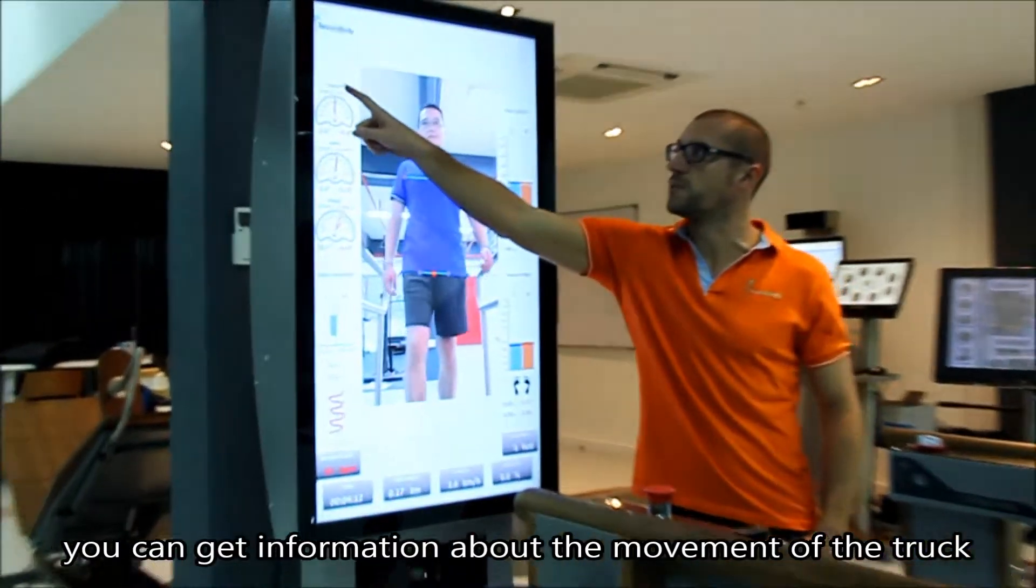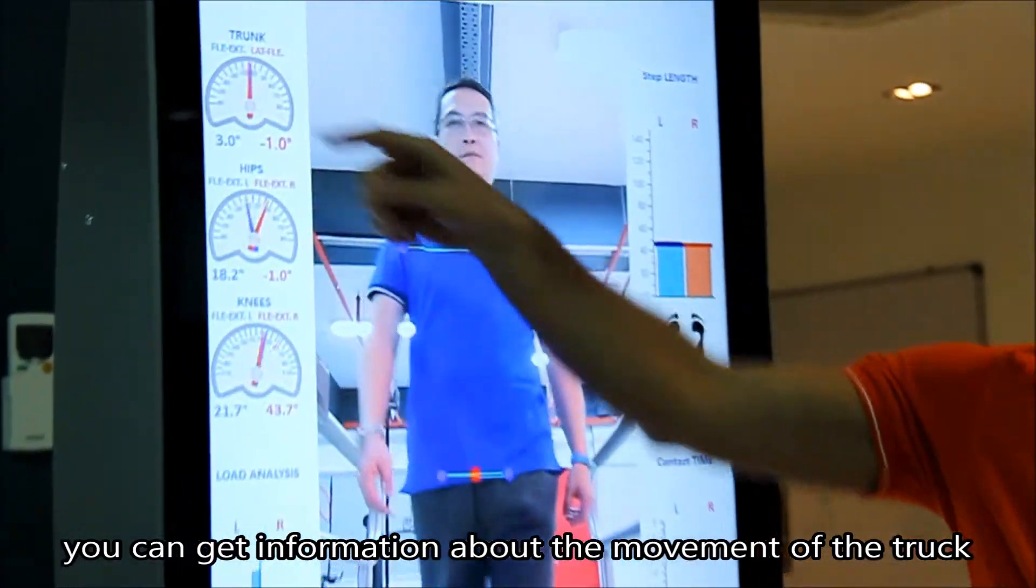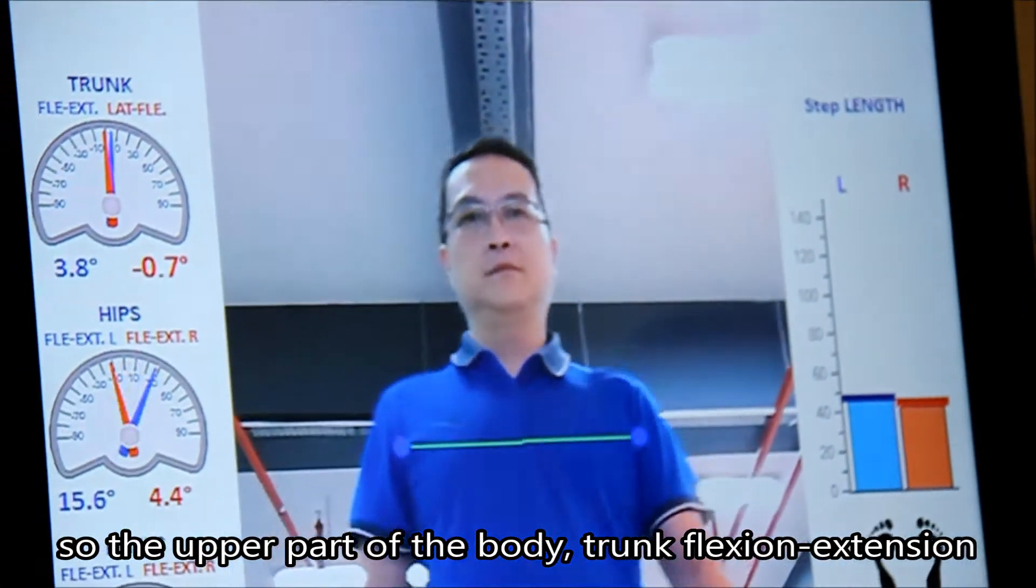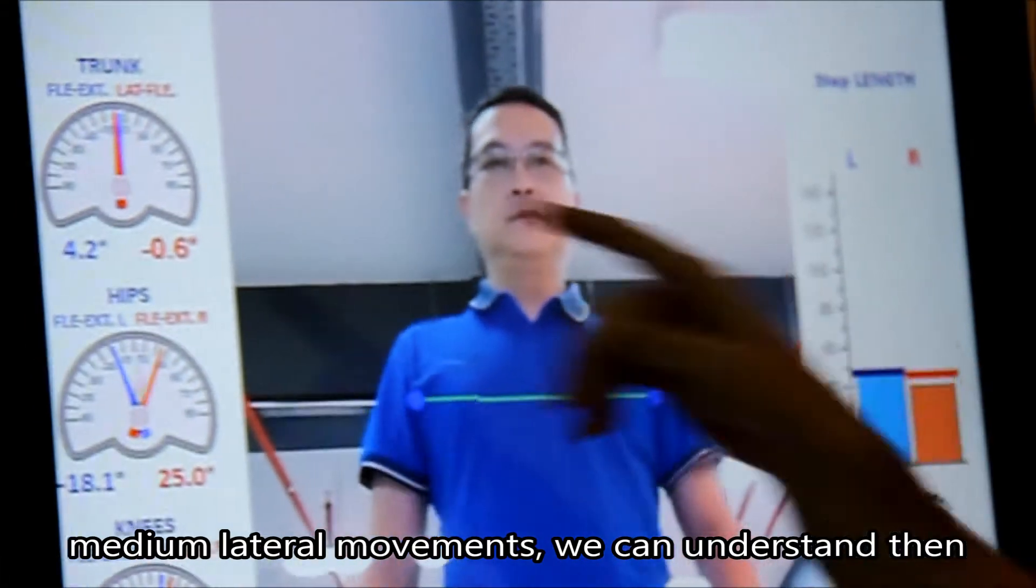We can get information about the movement of the trunk, so the upper part of the body, in flexion, extension, and medium lateral movements.